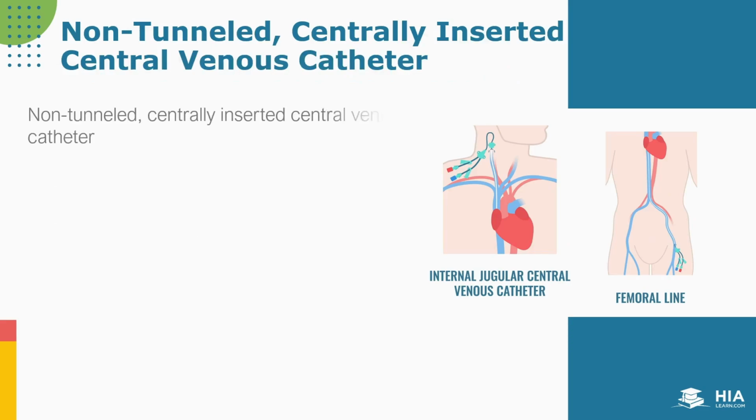A non-tunneled centrally inserted central venous catheter is commonly called a central line or CVC. It may also be referred to as a VAD or vascular access device, which is a more generic term for many kinds of devices used to access the vascular system.